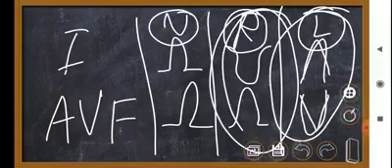Now I give you some examples of the ECGs that will make you understand. This is a 12 lead ECG, and just focus on lead 1. The direction of QRS complex is upwards, and now focus on lead AVF. The direction of QRS complex is downwards, so it's like this: lead 1 here and lead AVF here, so it's left axis deviation.